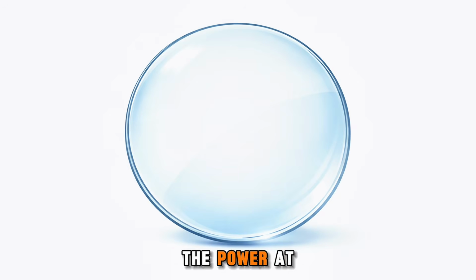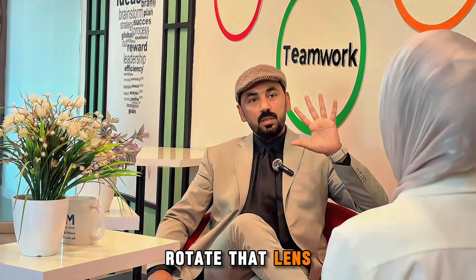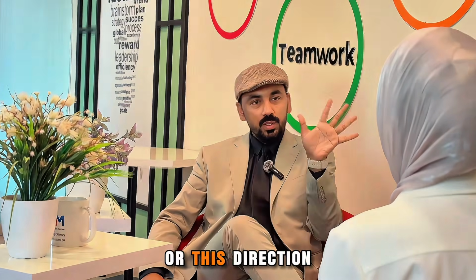Thank you so much, Kashmala, and welcome back again. The main difference between spherical and toric lenses is that in spherical lenses, the power across the whole lens is the same. If a spherical lens is +2 diopters, for example, and I rotate that lens in any direction, the power, which is +2, will be the same in any direction, right?